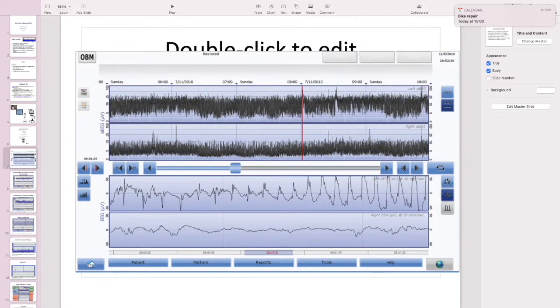You can check the impedance to make sure that there isn't a high impedance, otherwise you won't get a good tracing and you won't get a good CFM readout. You can also combine the 2 leads if you just want to look at them amalgamated into single leads as well.